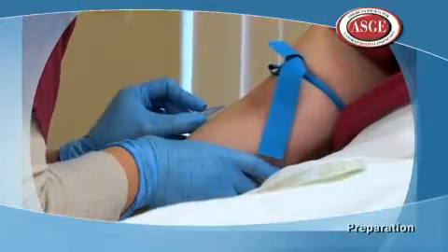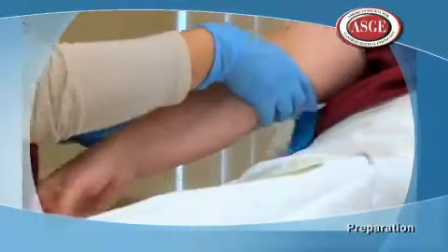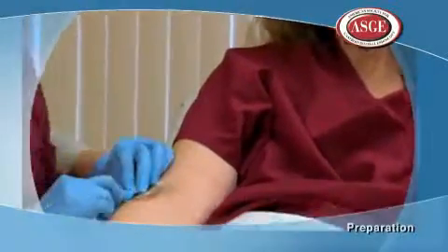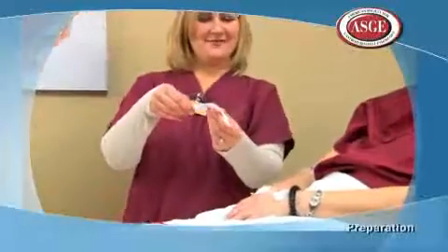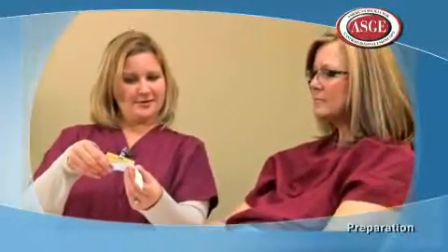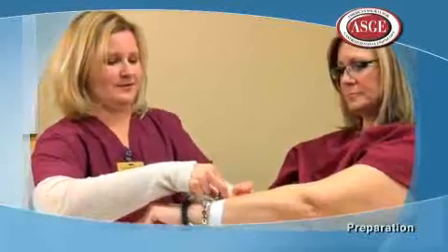The majority of upper endoscopies are performed with sedation, which involves getting medication through the vein to make you sleepy. This is so you are made comfortable during the exam. Upper endoscopy is a well-tolerated procedure. Though you may feel some sensations during the procedure, most patients are not even aware that the exam has occurred when they wake up after it is done.